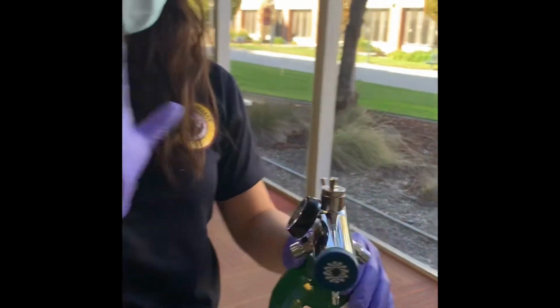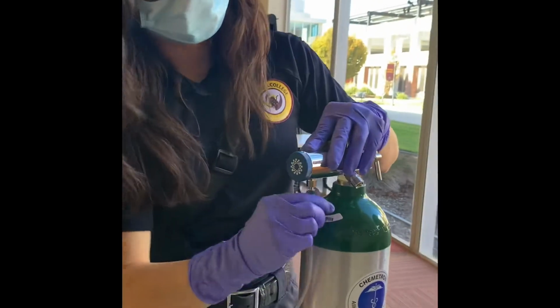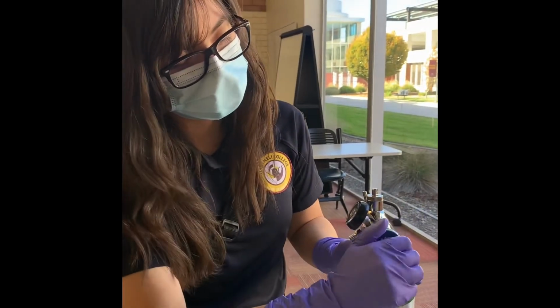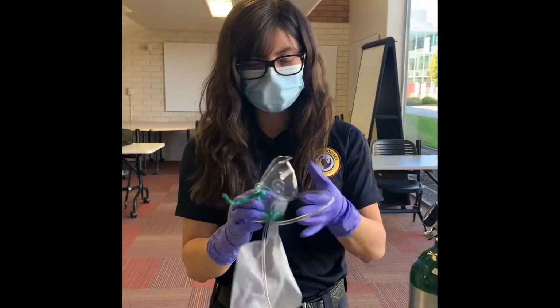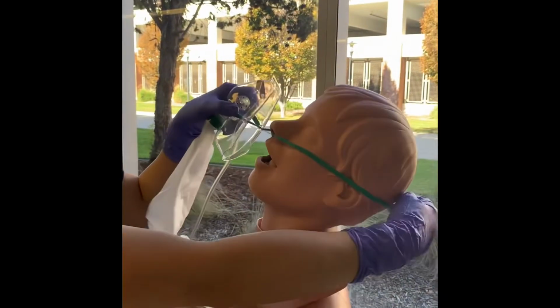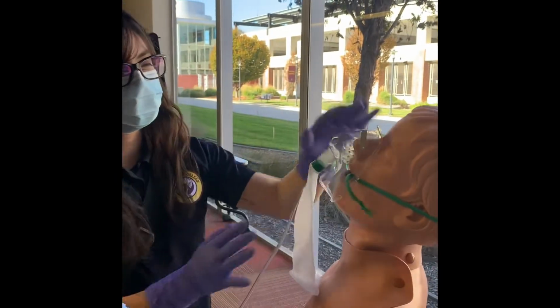So 2000 PSI. I'm gonna attach my non-rebreather mask. And I'm gonna set my regulator to at least 15 liters per minute. I'm gonna pre-fill my reservoir bag with oxygen. I'm gonna put it on my patient and make sure it's a nice snug fit.